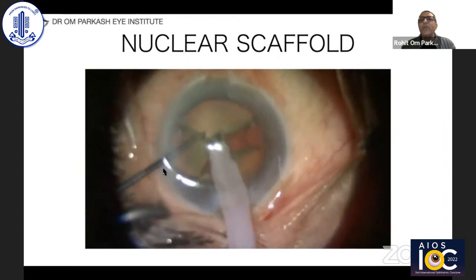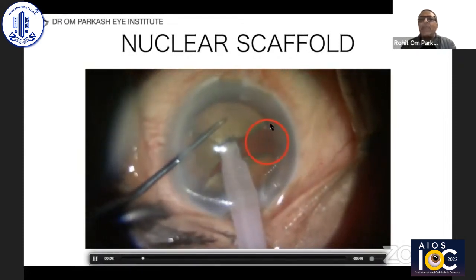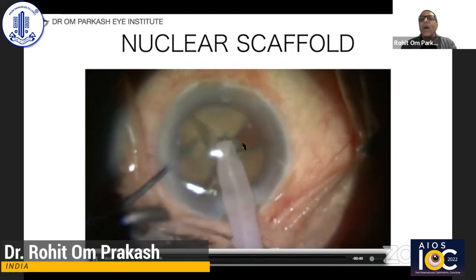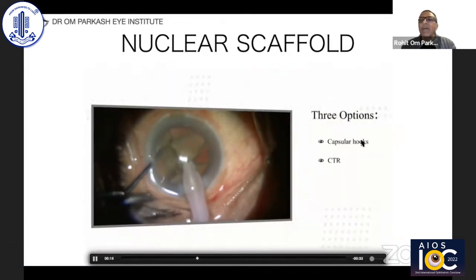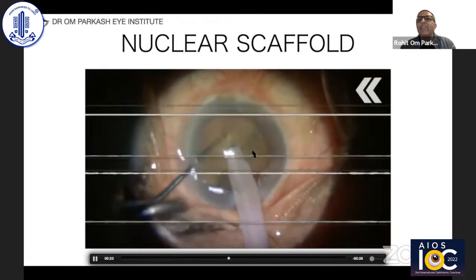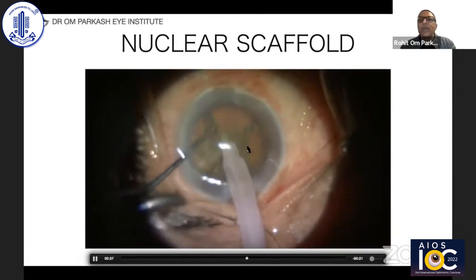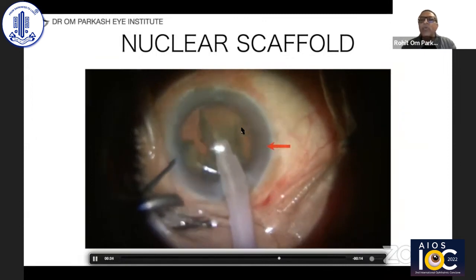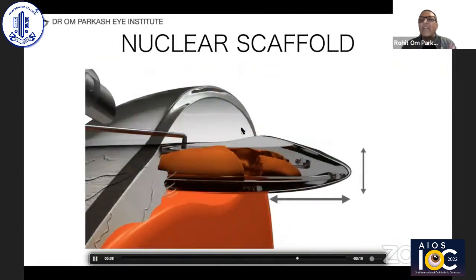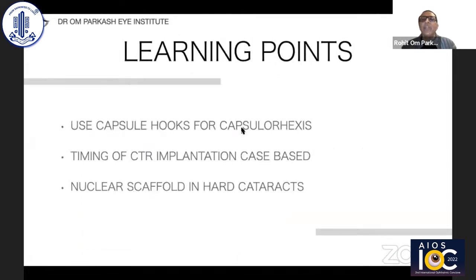Now I would like to show a nuclear scaffold. Here there is an area of zonular weakness and the options are a capsular hook, CTR, or nuclear scaffold. When the nuclear fragments were present in the area of zonular dehiscence, they were providing three-dimensional support — this is the nuclear scaffold concept. Nuclear scaffold can be used during surgery in patients with zonular dehiscence, provided the nuclear fragment is hard. The learning points: use capsular hooks for capsulorhexis; timing of CTR implantation is case-based; and nuclear scaffold can be used in hard cataract types.